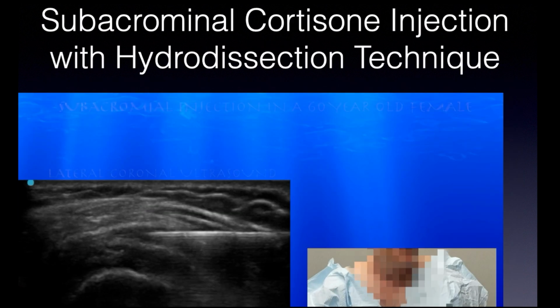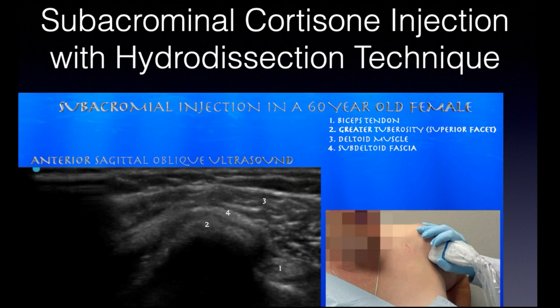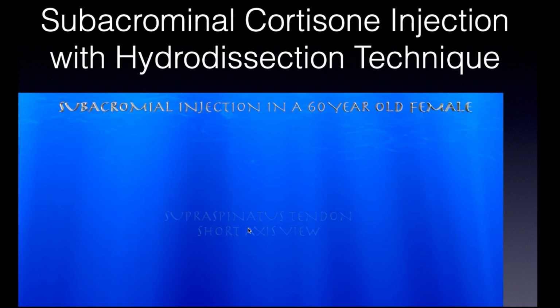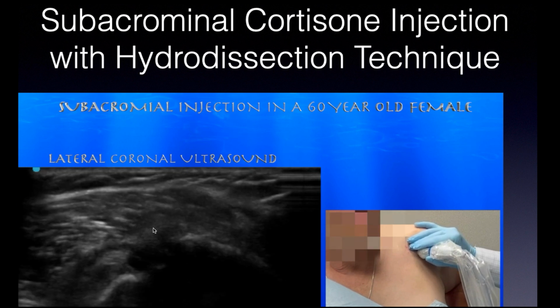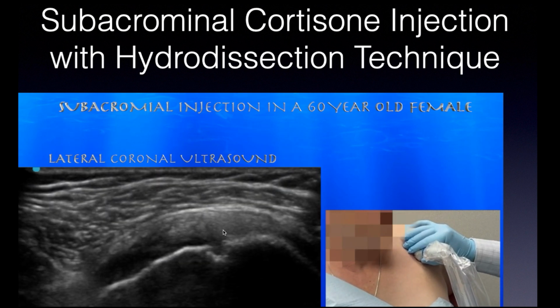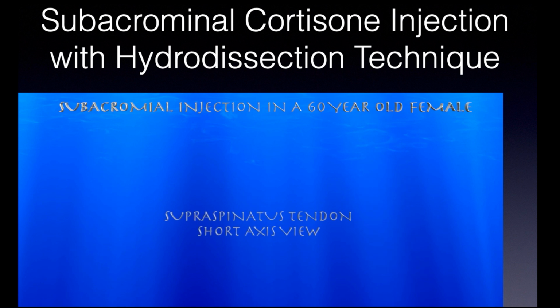So here's another case, a more recent case where I used about 2.5 cc's of saline and then a little bit of cortisone. So here's this patient, supraspinatus tendon. She had a little bit of a rim of degenerative, linear calcification. And this may be more degenerative, like Dr. Jacobson mentioned, so I didn't try to barbotage this. She wasn't really complaining of a calcific tendinitis kind of thing. She had more impingement type symptoms, chronic pain with motion.